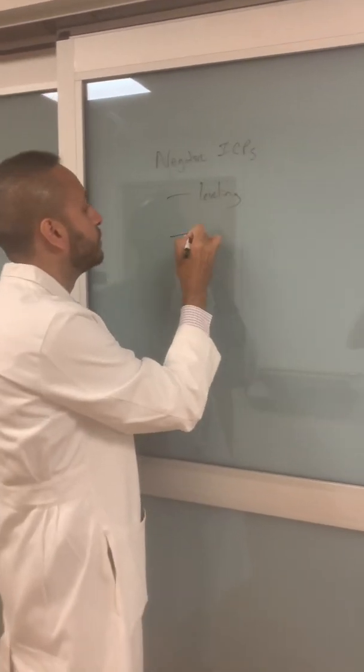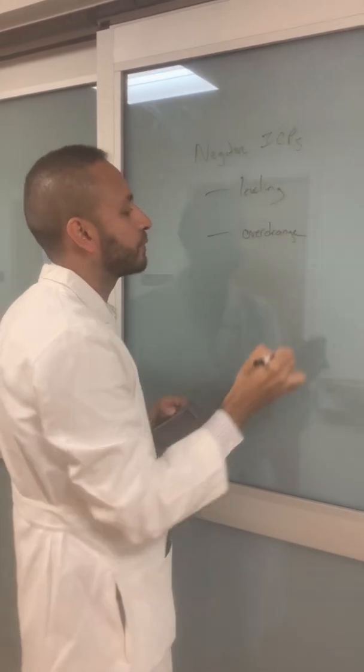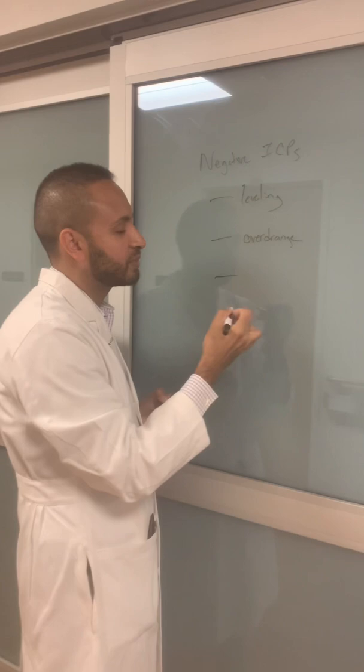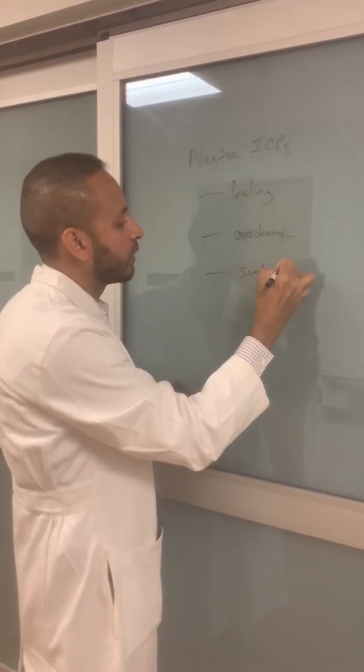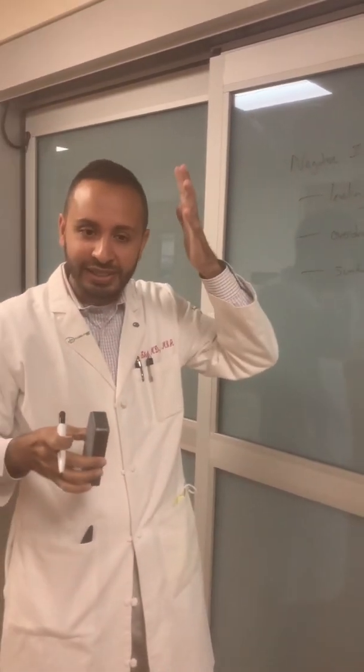All right, two, over drainage can be a problem. When you over drain the patient too much, the brain sort of shrinks in, and you get a negative number. The other thing that you'll see sometimes, we probably won't see most often, is a sunken flap, all right, syndrome of the trephined. So where their actual external pressure is higher than the internal pressure in a decompression patient, these patients go comatose just because they have very low ICPs, and the way to cure them is actually to put them flat.